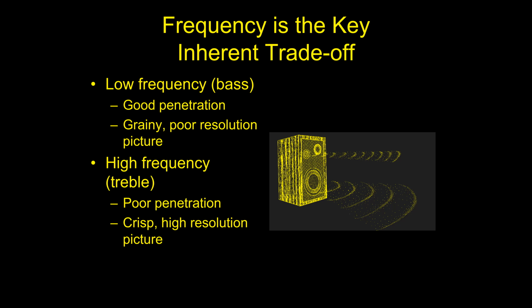And so you can tell with this is if you had a cat only practice and all you're going to be doing is imaging cat abdomens, you can get away with buying one ultrasound probe, and it can be a high frequency probe to give you a really pretty picture because the cat abdomen is only going to be about that big. Okay. On the other hand, if you're like most veterinarians and you're going to do dogs also, and you have great big dogs that come in, you're going to need a lower frequency probe to be able to penetrate that much soft tissue, right?